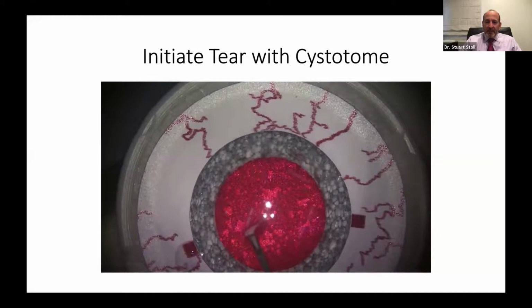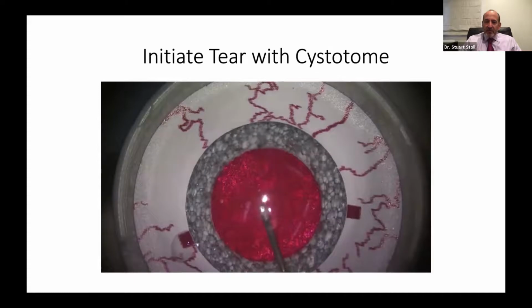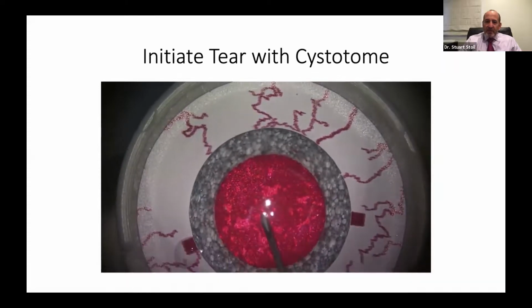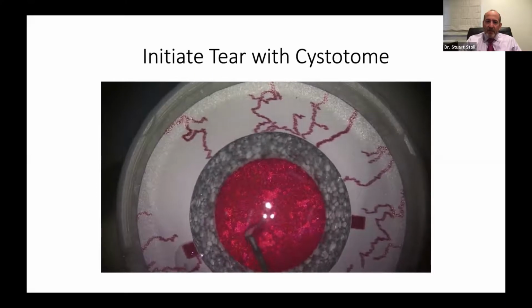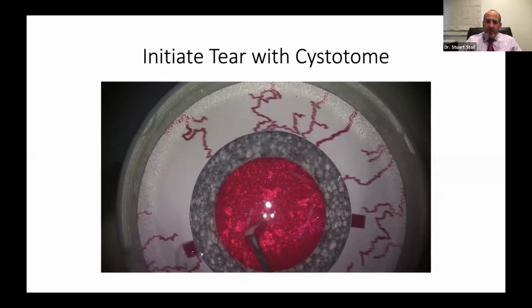And look at that nice, precise tear. It's cutting the capsule. And then we start to pull back down towards the incision, and that's what's going to lift the flap. So let's watch that one more time. Pierce in, go exactly horizontally, nice tear, and then when you get to where you want to, pull down. And again, we can use that bevel as a 2 millimeter indicator inside the eye.